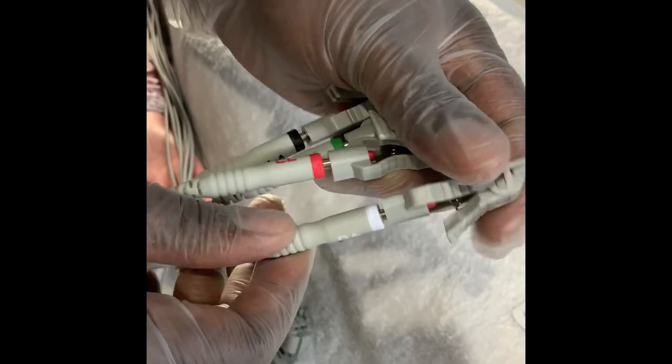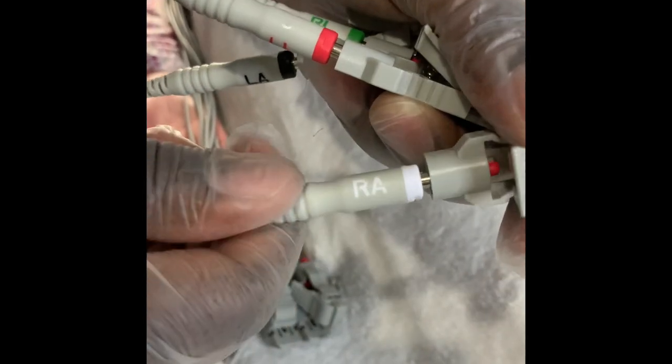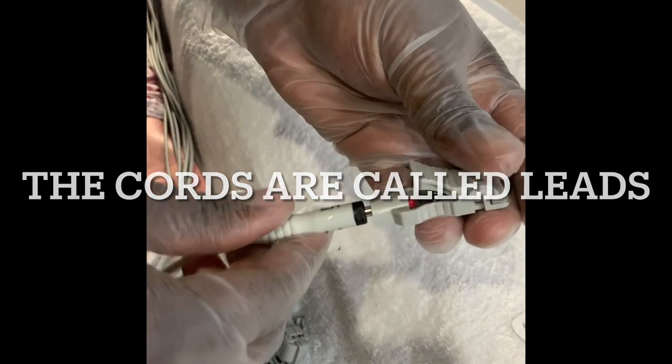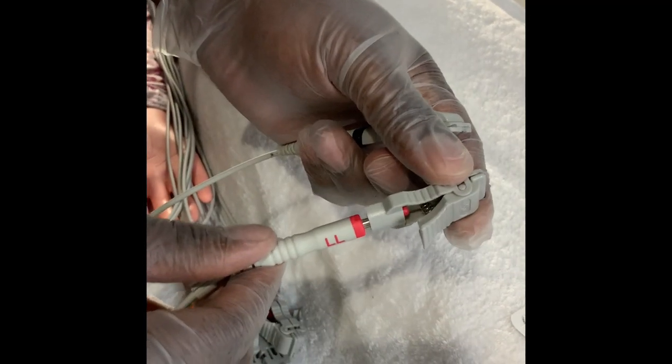As you can see right here on this lead, RA stands for right arm. RL stands for right leg. This one stands for left arm. And LL stands for left leg.